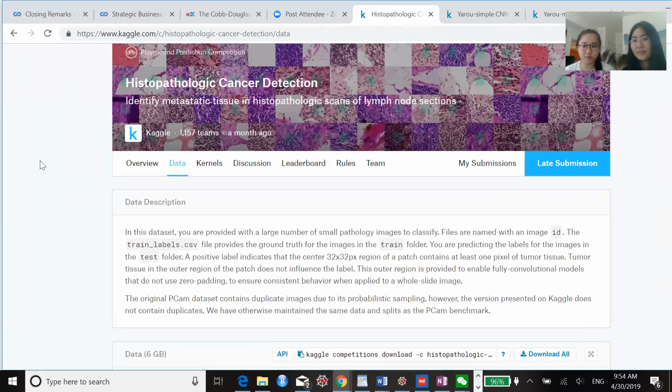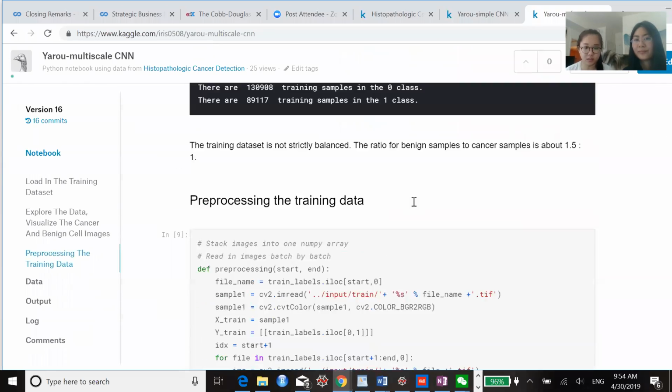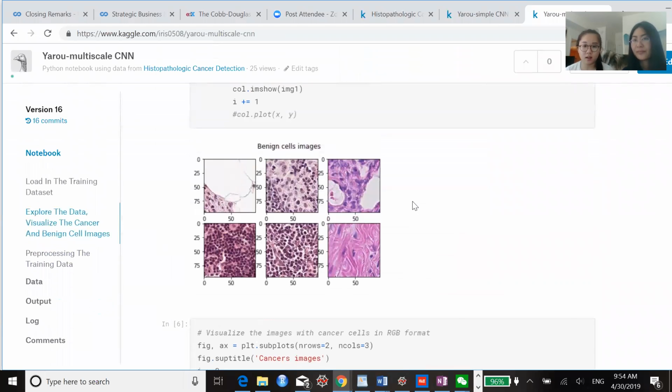In previous related works, the multi-scale approach has been utilized to solve a lot of low resolution and smaller feature detection and classification problems. For instance, one of the previous papers talked about the same issue: if you want to detect a mouse or a telephone in a really large image, a lot of papers use this multi-scale approach, and their results appear to be very accurate. So this is why we decided to use multi-scale for our project.